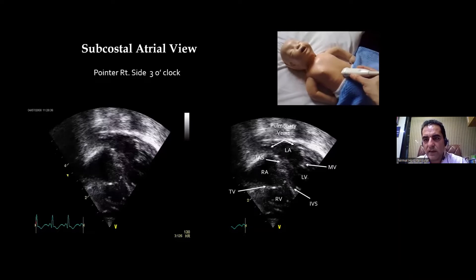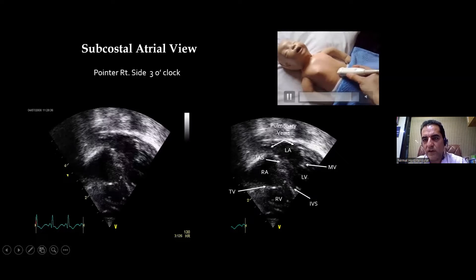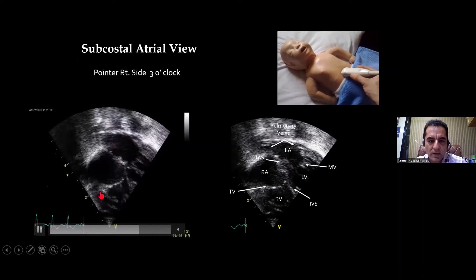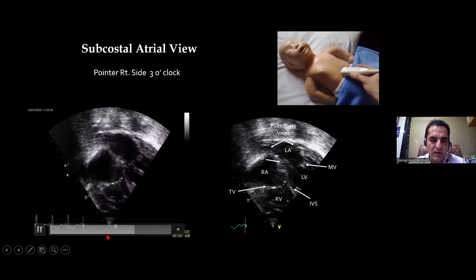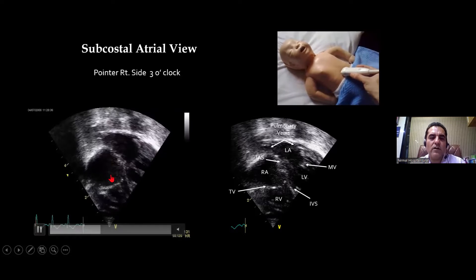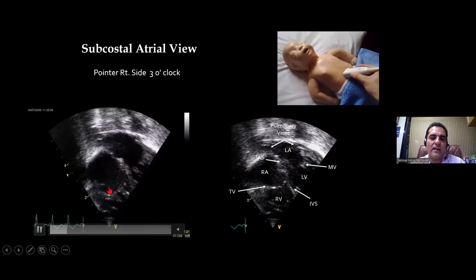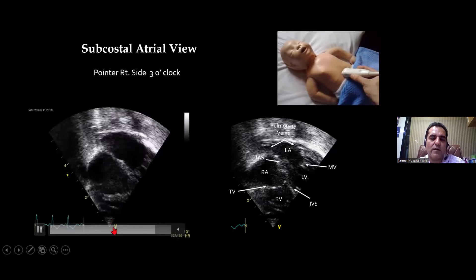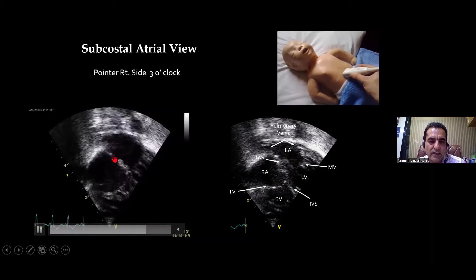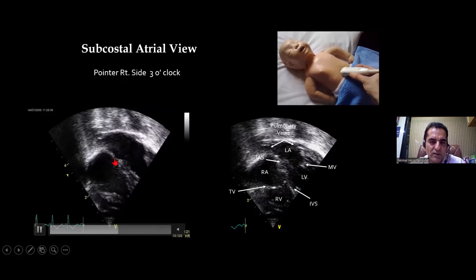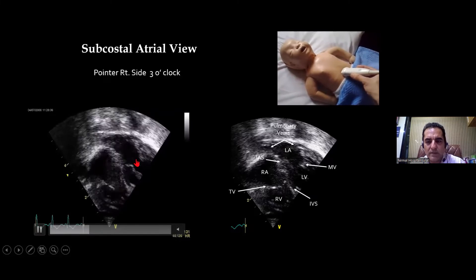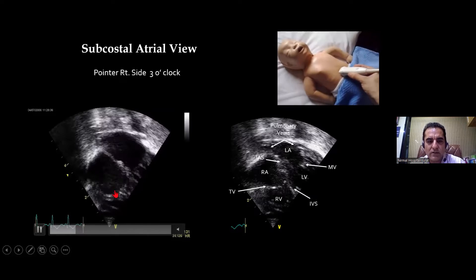Here is my probe — pointer is pointing at 3 o'clock position, just below the xiphisternum. You will notice we have brought this probe orientation marker down, because with this orientation the RA is nearer to the probe. So this is my RA, LA, intra-atrial septum — this is the flap you are seeing, so this is the PFO. And these are the two pulmonary veins entering into my LA. And this is your tricuspid valve.